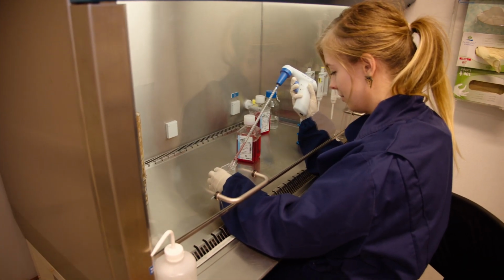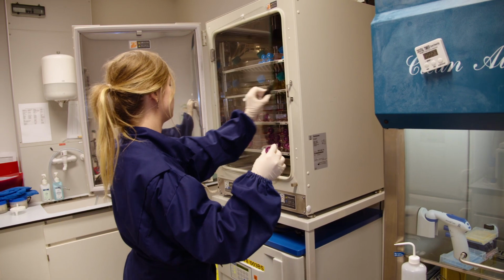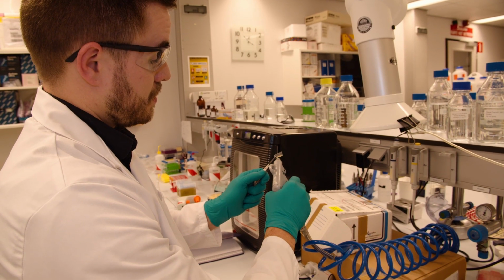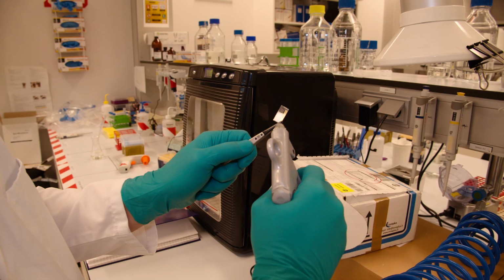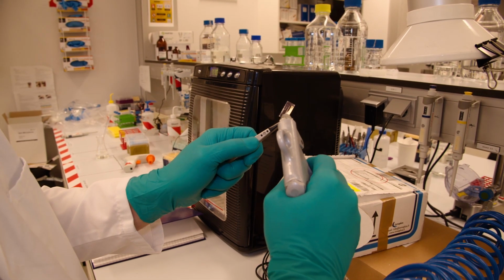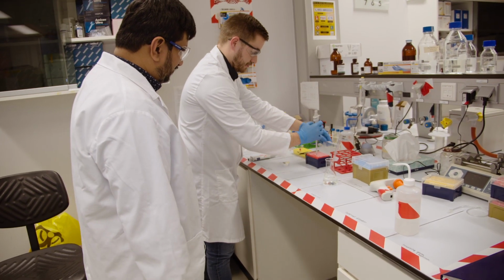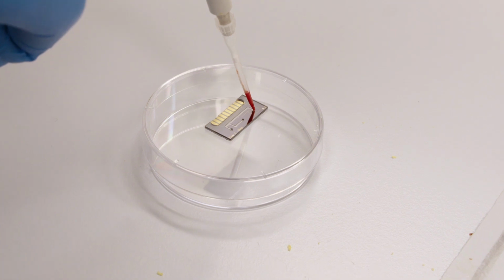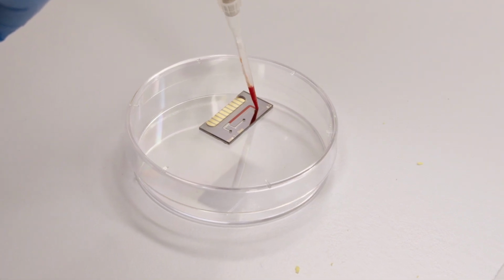In the cell culture lab, we produce antibodies in cells. These antibodies specifically recognize certain biomarkers. This is where the nanosensors are chemically modified. The coating needs to efficiently bind the antibodies, but it also needs to reject other things. The sensor measures biomarkers in drops of blood, and as you can imagine, blood is a very complex fluid with hundreds of components.